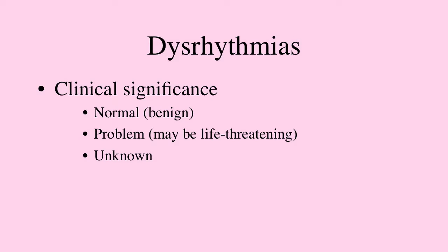So normal sinus rhythm is where you have initiation of the beat at the SA node, and therefore you have a P wave. There's a regular P to P interval. The rate is 60 to 100, including 60 and including 100. Page 43 at the top shows a couple of examples, and the next slide also, where you have just a normal P wave with every QRS, a normal QRS complex, and everything is beating along as it should, with a rate that's 60 to 100, including those numbers.